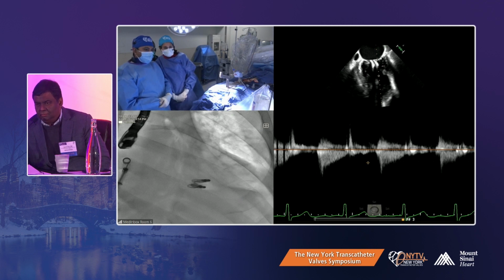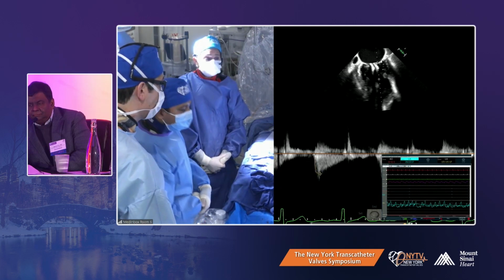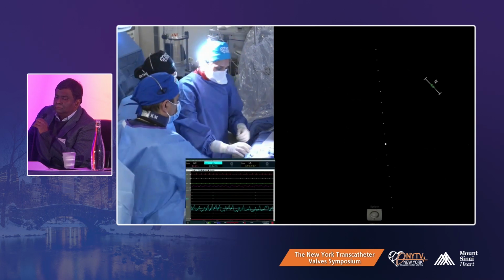Clips look parallel by echo. Wow, the V waves actually have gone down. Look at that. Oh, that's beautiful. Just very small V waves. That's a beautiful result.